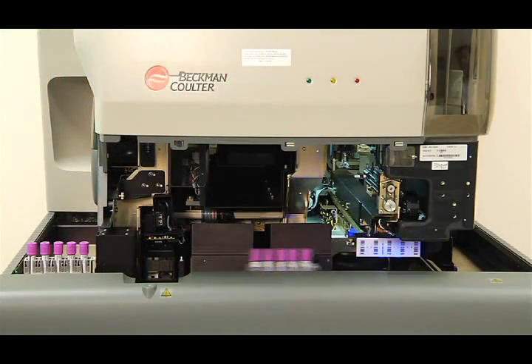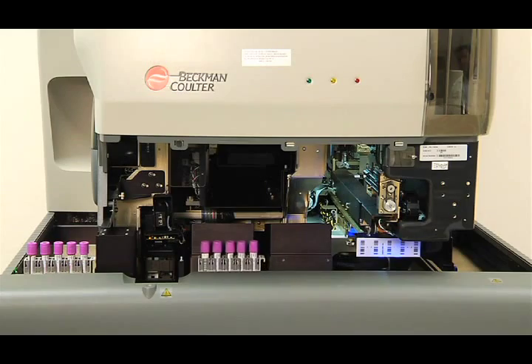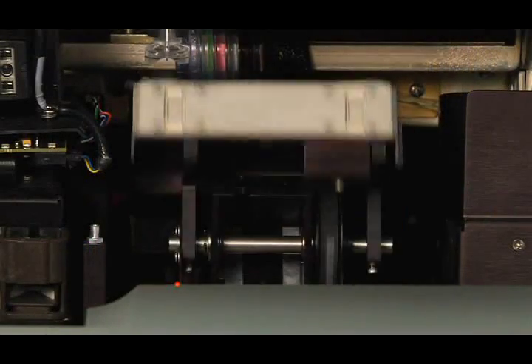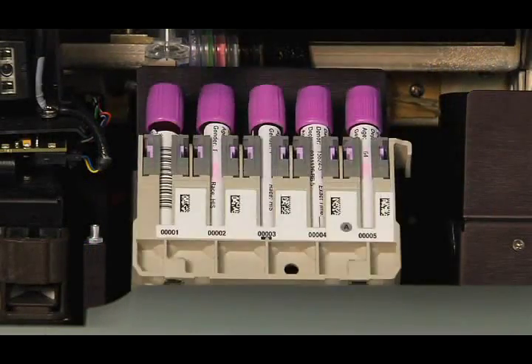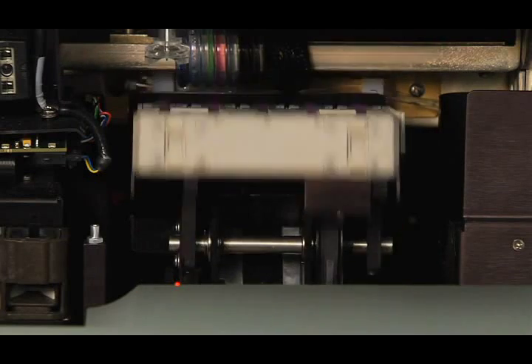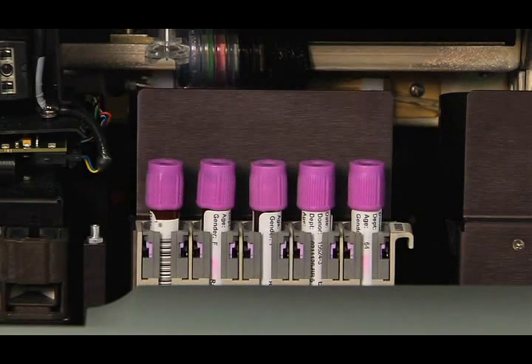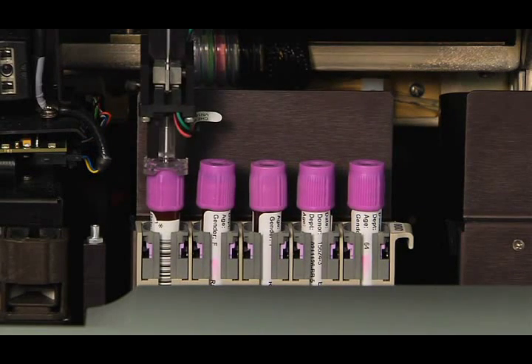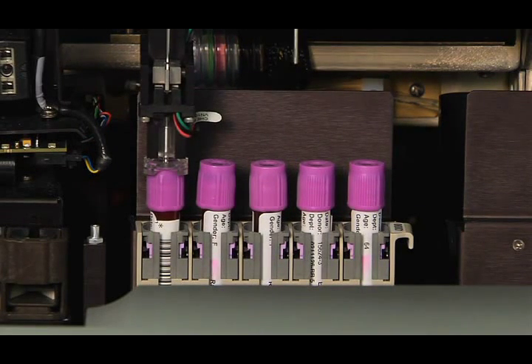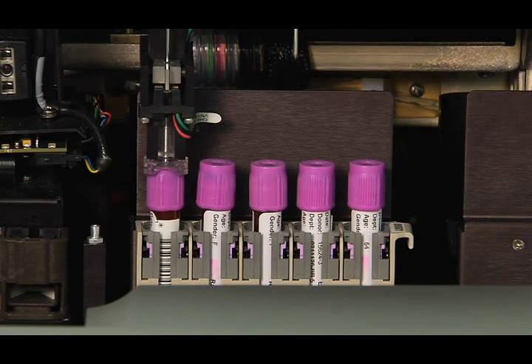The cassettes then advance to the mix station. The specimens are mixed with a gentle rocking motion. Then the aspiration probe aspirates the sample that will be used to create the slide smear.